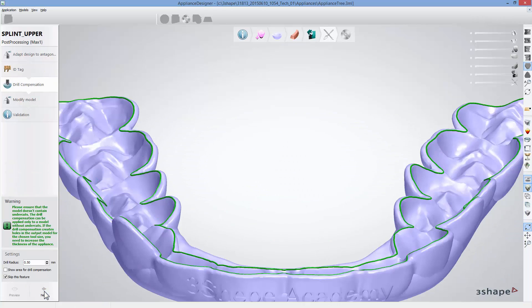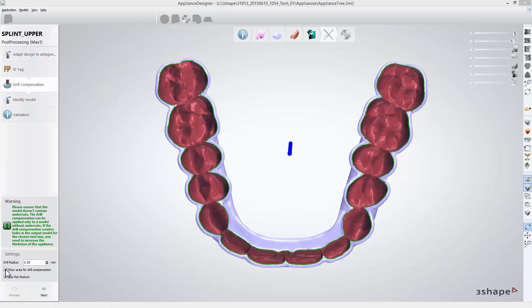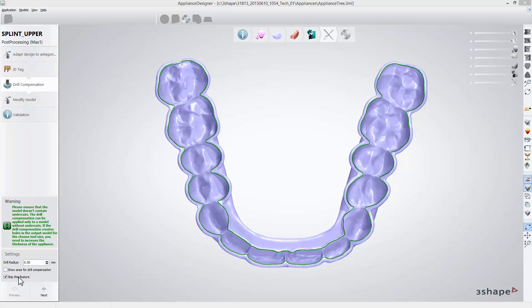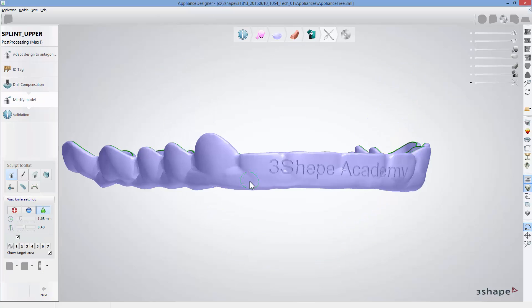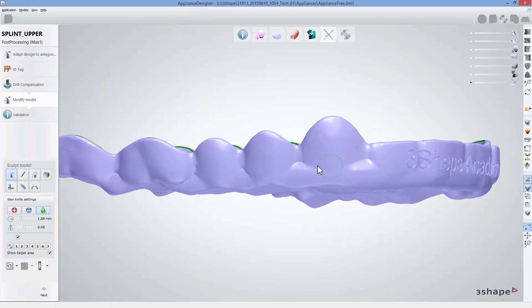If you are going to mill your splint at the next step you can add drill compensation. But if you will not, select the box to skip this feature and click next to adjust your splint and bar design using sculpt toolkit.